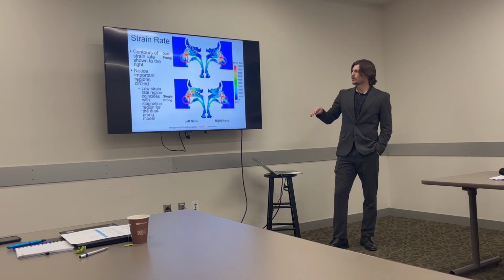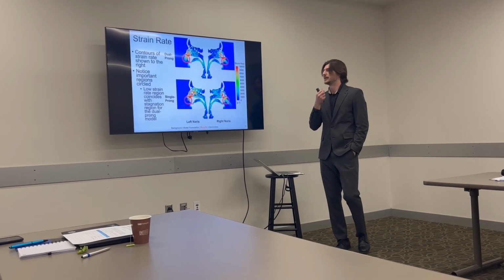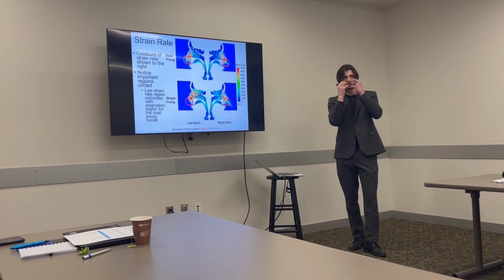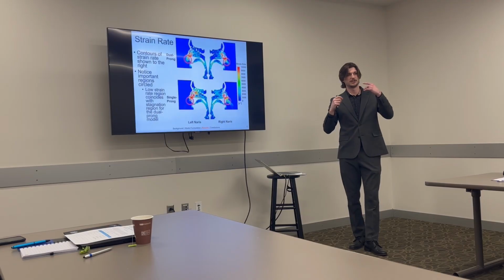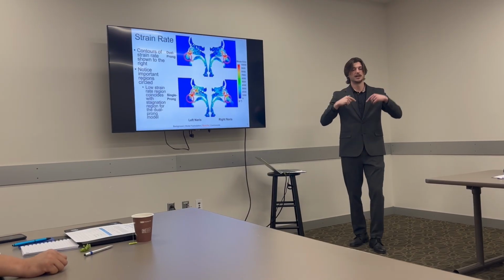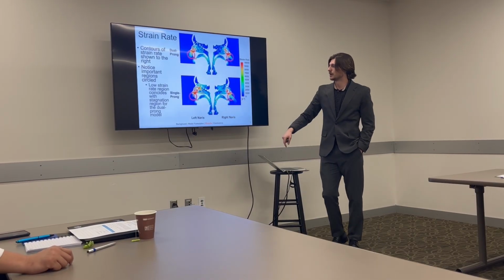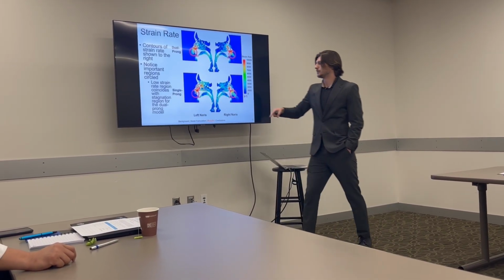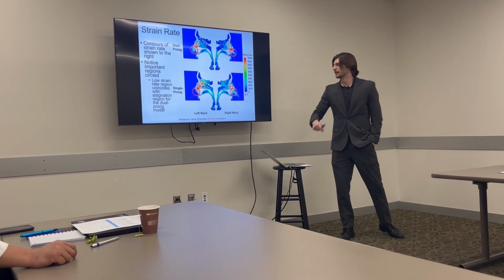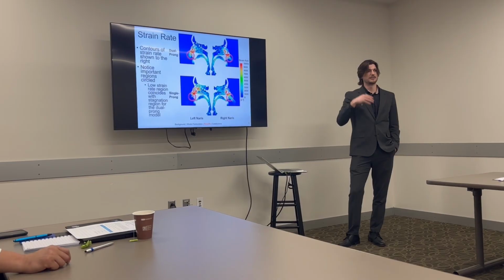Some other regions where we noticed some distinction were right around the cannula geometry, or really the exits to the nares. For the dual prong geometry, we could see some high mixing right outside the cannula, where we noticed in those animations that the therapy flow was trying to make its way into the nasal passageways and then getting kicked back out. So we see some higher strain rates here, whereas for the single prong, right next to the cannula, we can see much lower strain rates, as we would expect more of that therapy flow to be unimpeded going up into the left nasal passageway. For the right nares that's open, we'd expect higher strain rates as that flow is escaping the airway unimpeded as well.